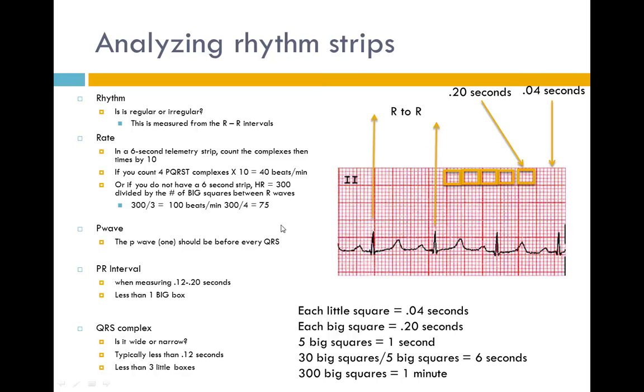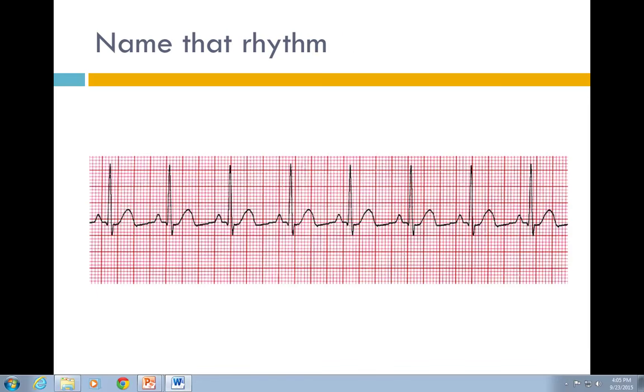All right, so that's how we're going to start to analyze these rhythms. So let's start with this first one. Let's name this rhythm. Let's try it out. All right, first, is this rhythm regular or irregular?